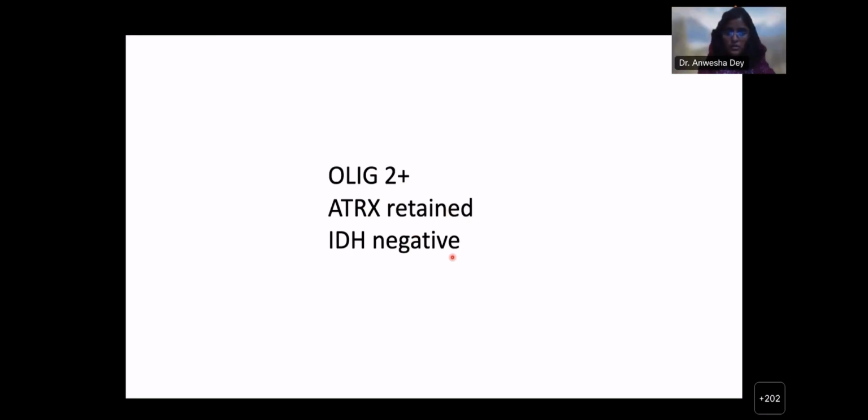Okay, so you're still thinking of an oligodendroglioma, and you actually ideally then should be doing a PCR for IDH to look for the mutation and a 1p19q for oligo. But we're not going there because that's an adult type diffuse glioma, which was dealt with in the last session. We're looking at pediatric type tumors. So do you think there are other?